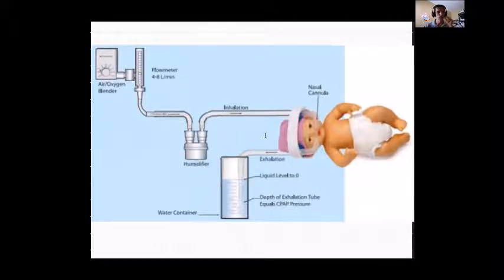Oh, no difference. It has nothing to do with the level of the patient. This container can be up, can be down, it can be at the same level. The container from the patient has nothing to do with it. It's the segment that is dipped in the water that is the measurement, because we're not comparing with atmospheric pressure. We're considering atmospheric pressure as 0.